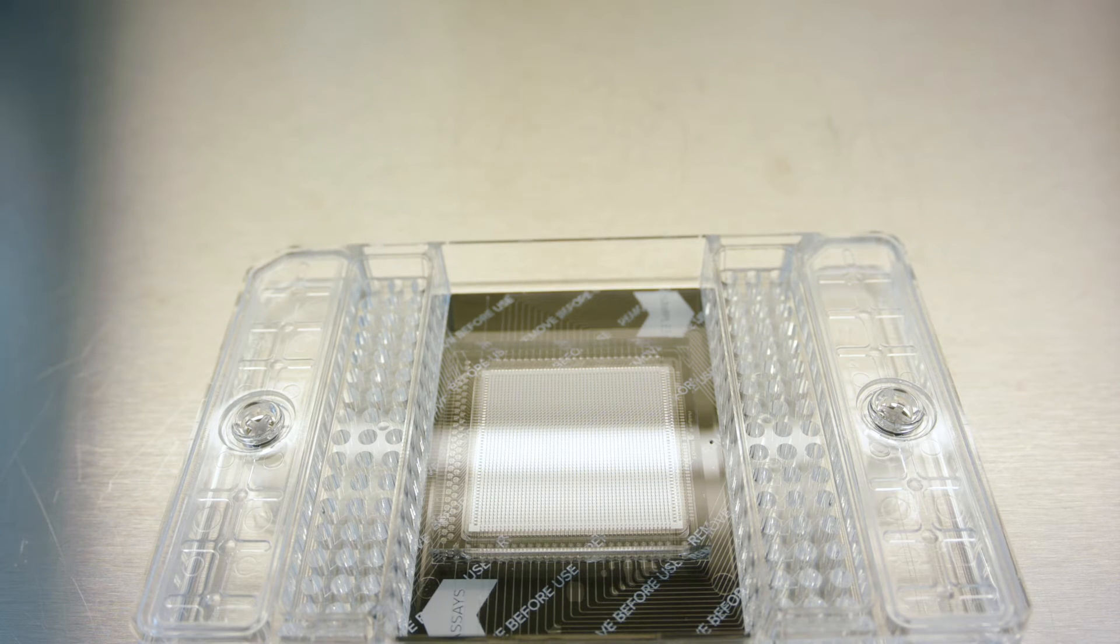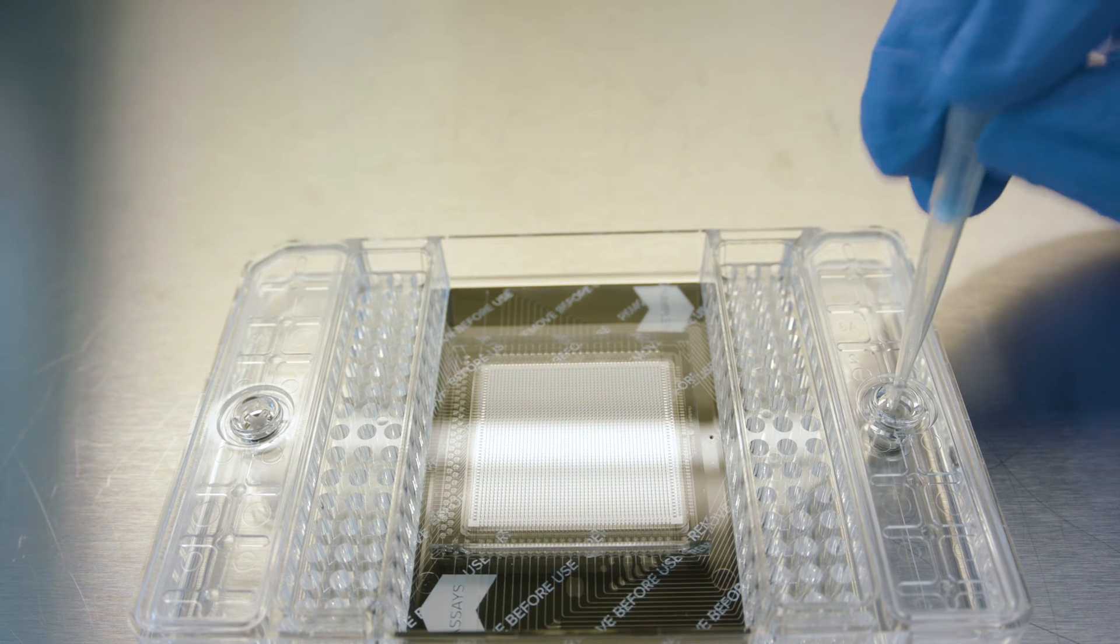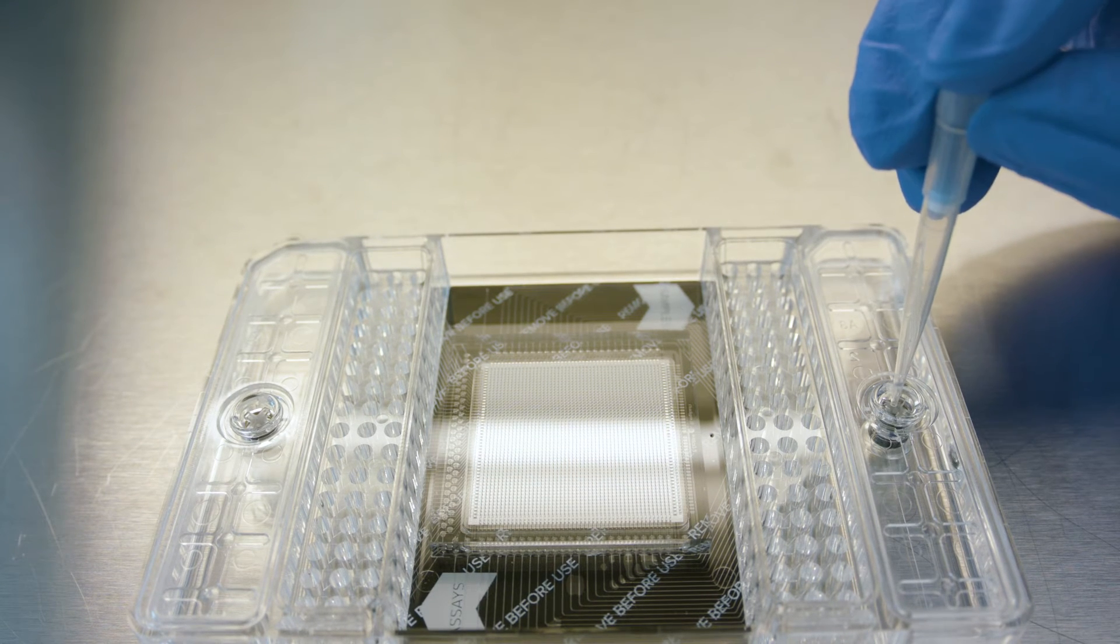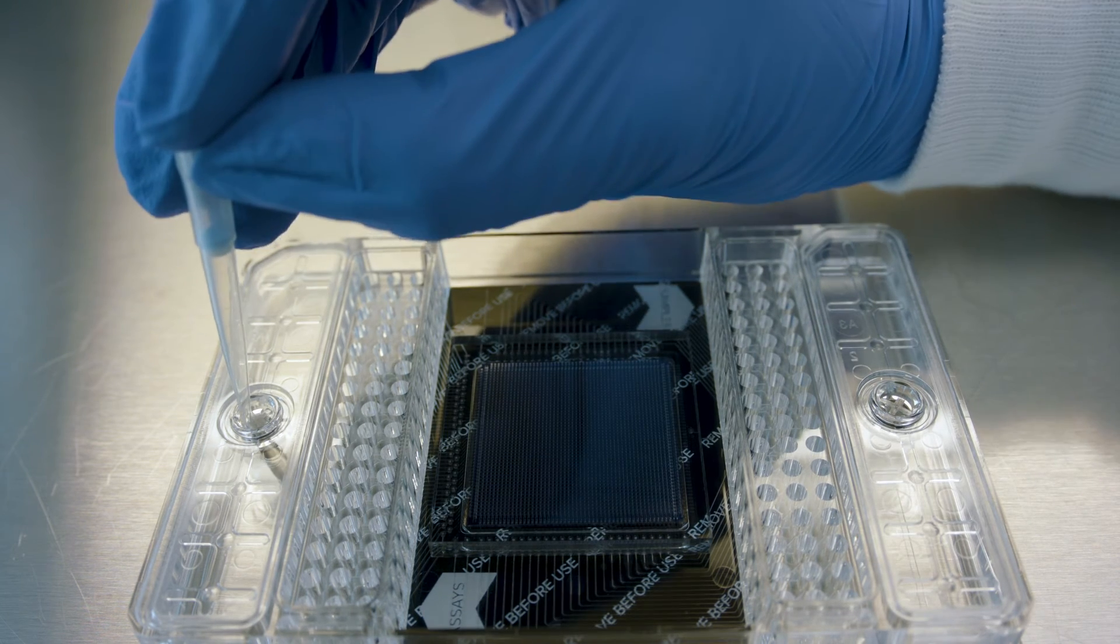Place the IFC on a flat surface, and using a pipette tip, actuate the check valve in each accumulator with gentle pressure. Ensure that the poppet can move freely up and down in the valve.